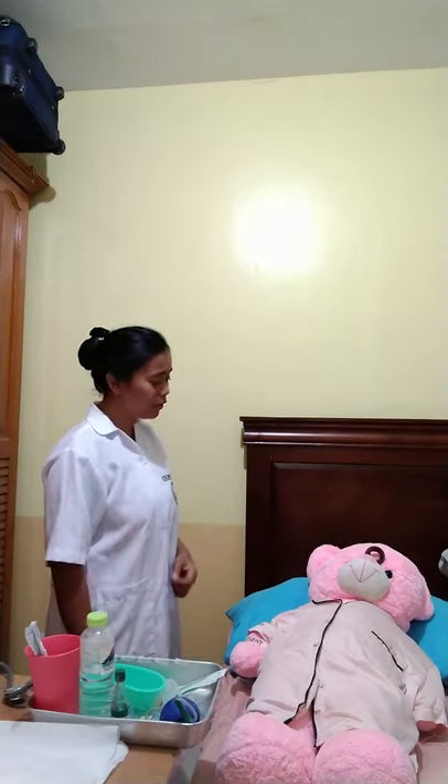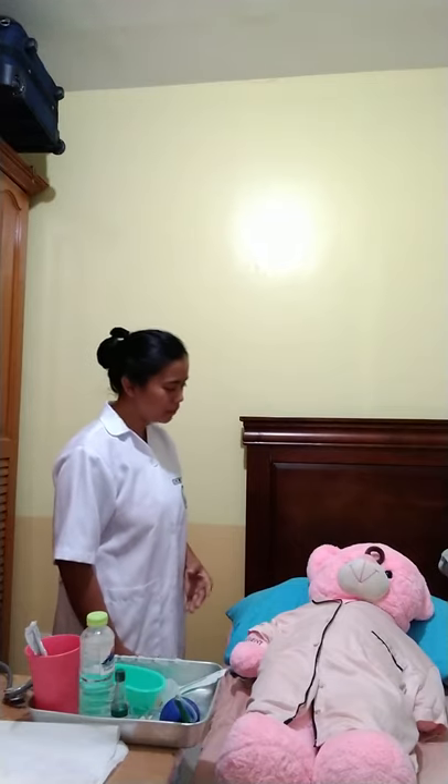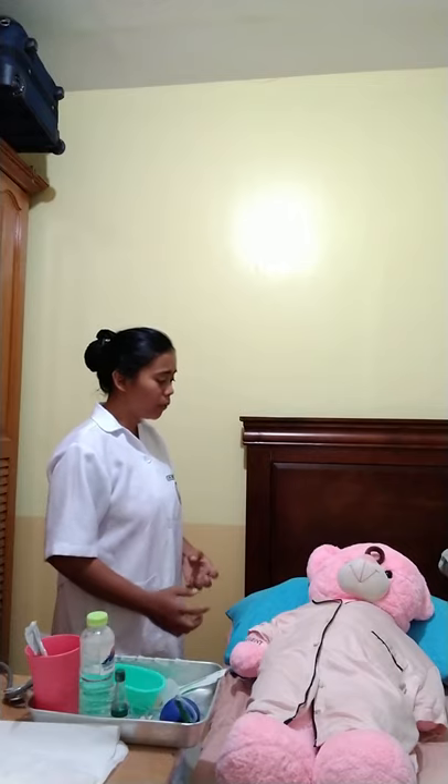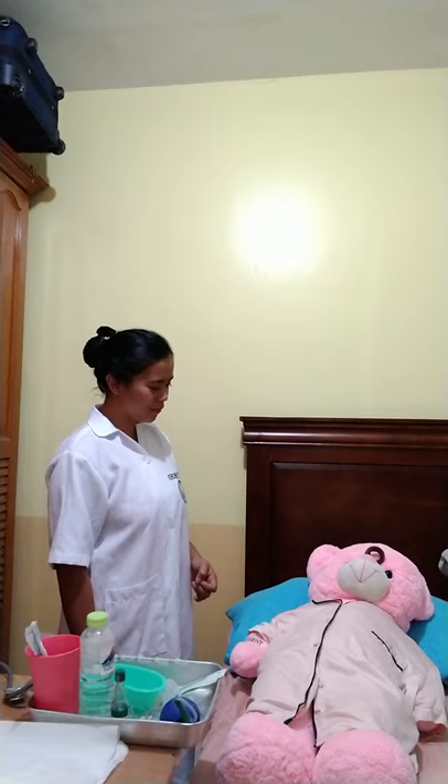After verifying the patient's complete name and birth date, the next step is to explain the procedure and the reason why. Tell the patient it will be a little bit uncomfortable, but taking deep breaths or relaxing will greatly help. So Ted, your doctor has ordered that we insert a nasogastric tube to your stomach. This procedure will be a little uncomfortable, but if you take deep breaths and relax, it will greatly help. Inserting this tube is important because you aren't able to swallow food, and it will help us give you the medication and nutrients your body needs for faster recovery.